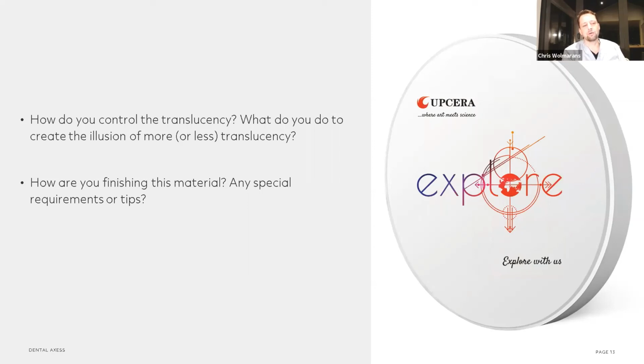It's always a good choice to consider the best strengths where you can. And the nice thing with this one is there's no real sacrifice in aesthetics and translucency, which makes it really great. So basically, you're saying you use a very strong zirconia, much more opaque, and a lower strength, more translucent. You've replaced it.